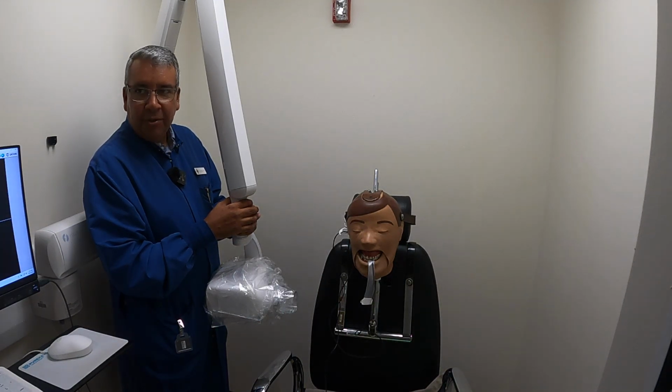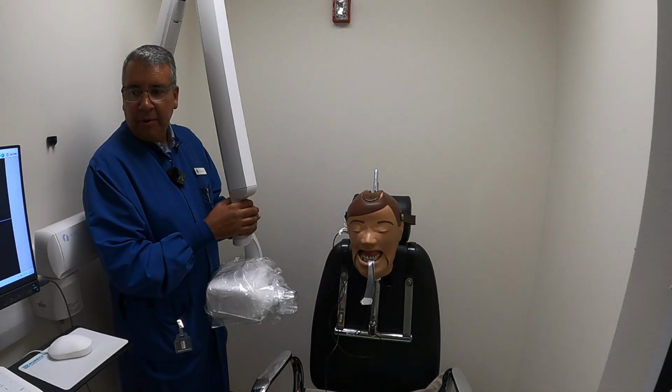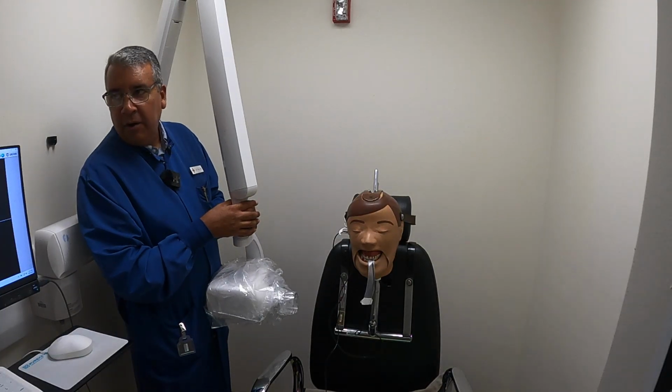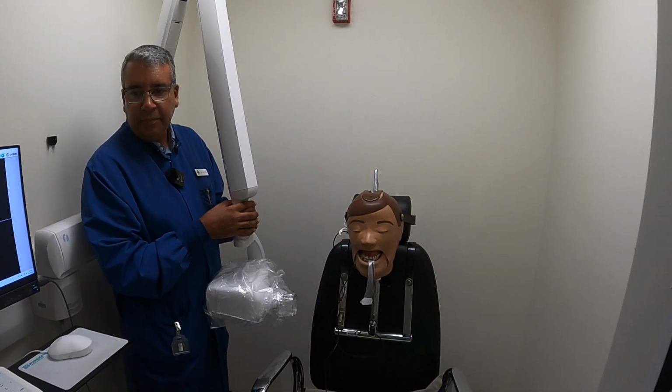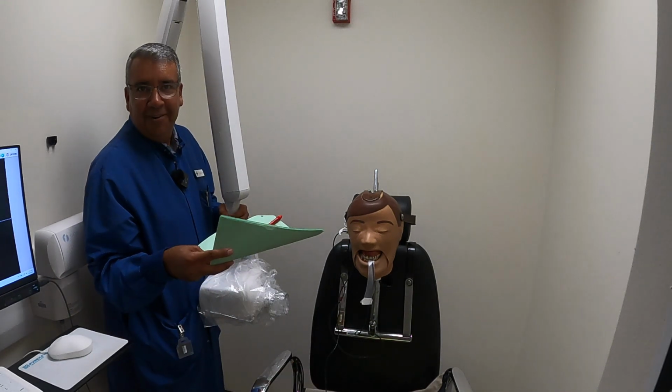I want you all to write this down. On the back of your paper, somewhere in the back, I want you to write down how we find our horizontal angle. Come in further.